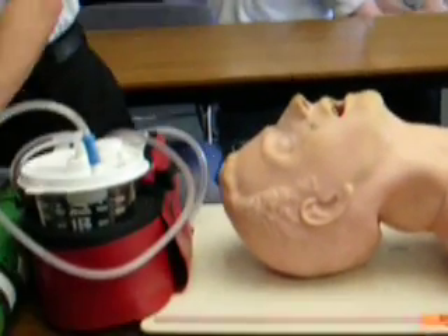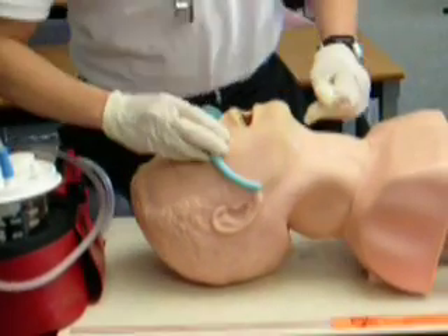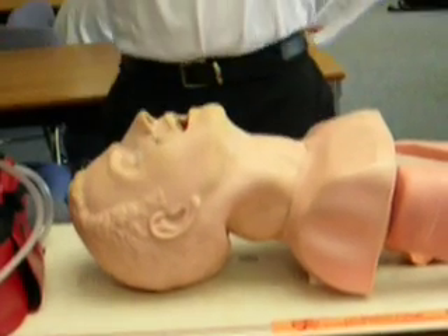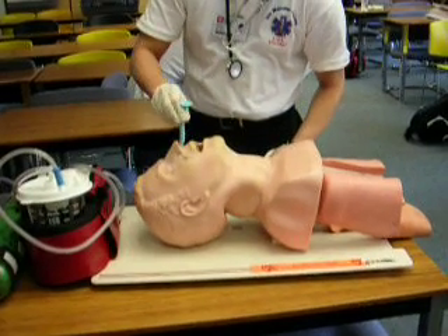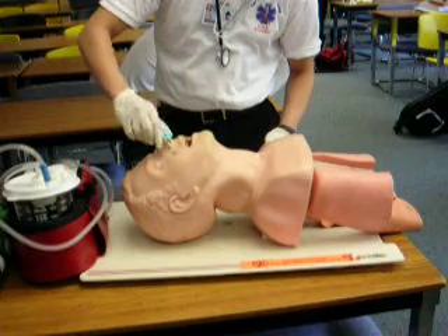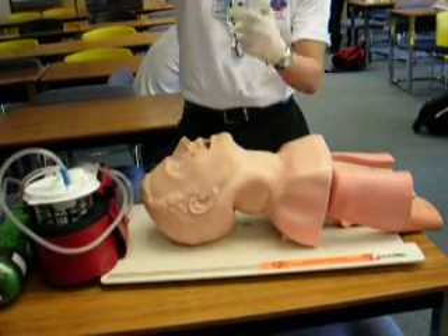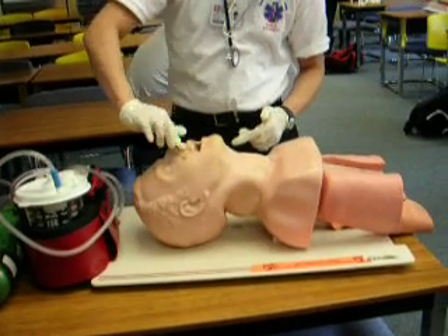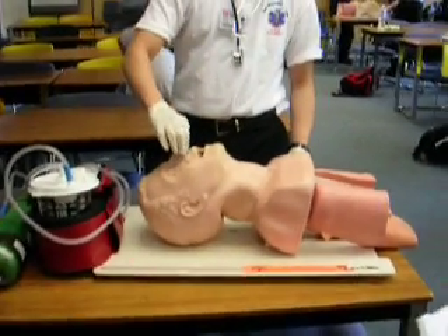Now I'm going to select a nasal airway and measure from the earlobe to the nose. I lube it up, put the bevel toward the septum, and twist. Then take it out, do the other side — still lubed up — put it in, and we're done.